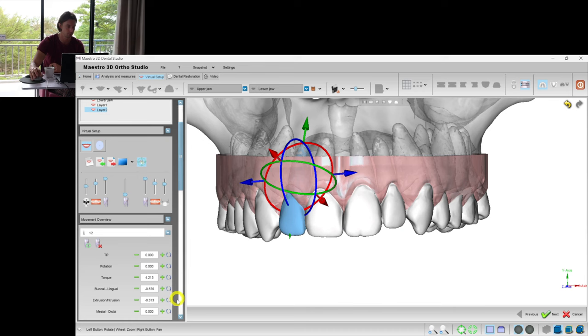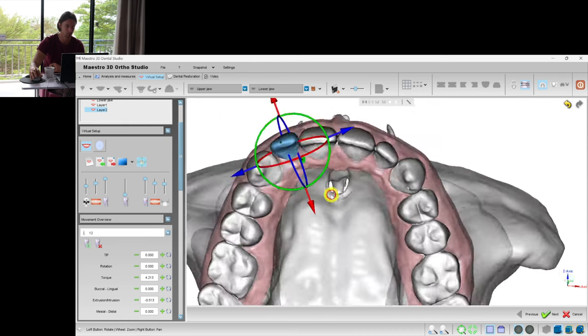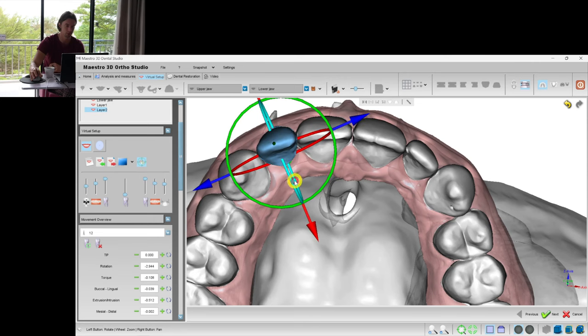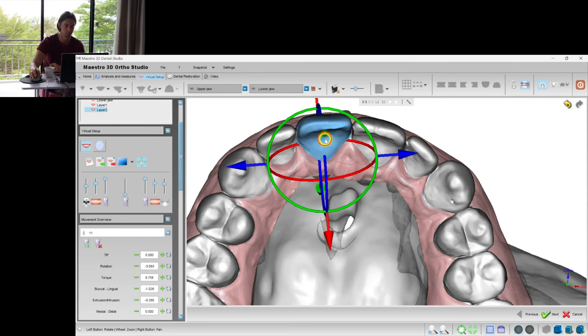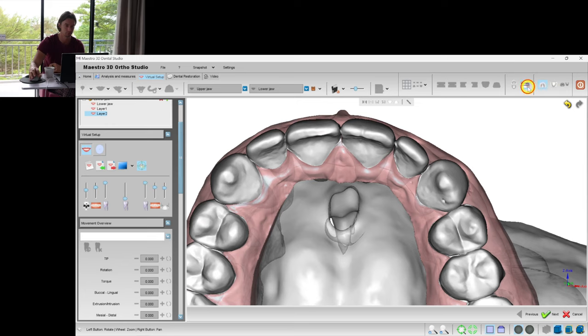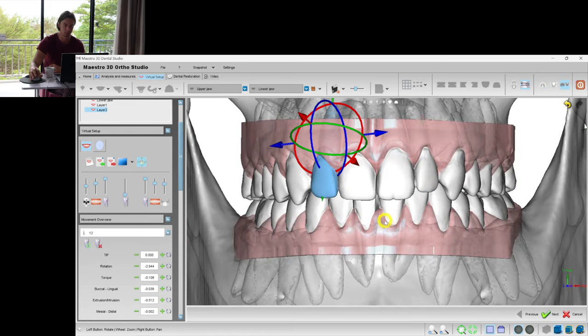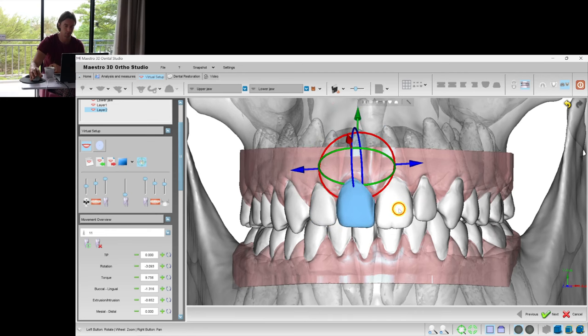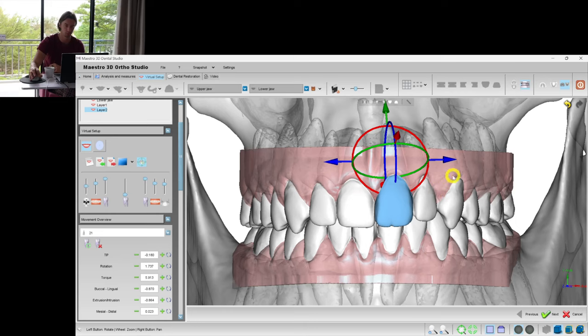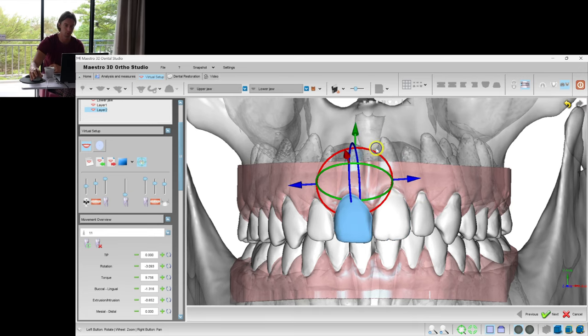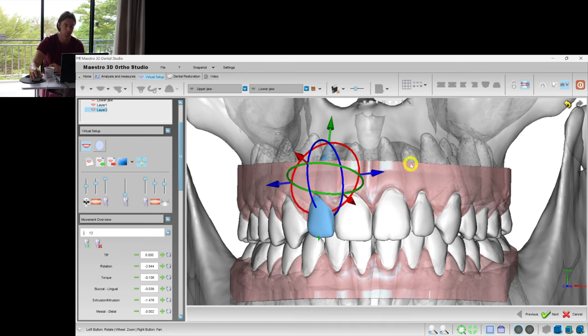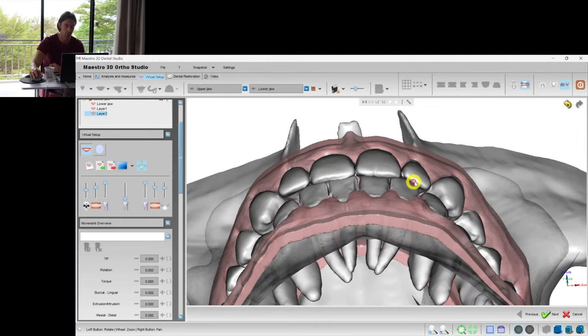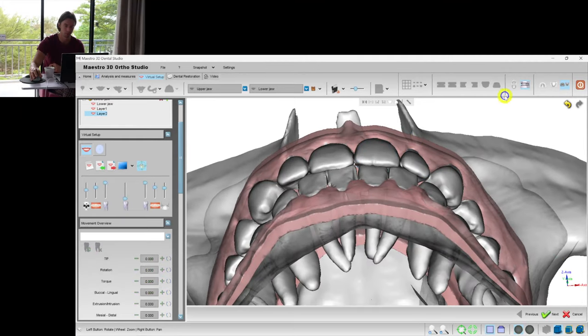Maybe for this one I would make more tipping to make the incisal edges more even. And here I see some imperfections in the vertical positions of the teeth. I don't like to extrude the teeth with aligners, except using some buttons and elastics. It's much easier to intrude the teeth rather than to extrude. So we'll adjust the incisors by intruding a few of them.